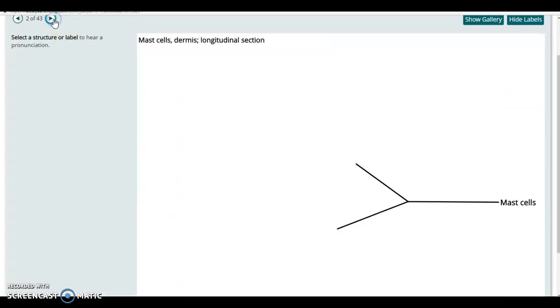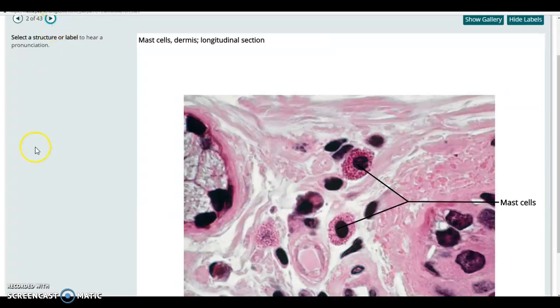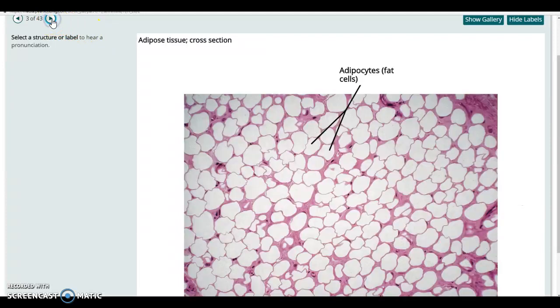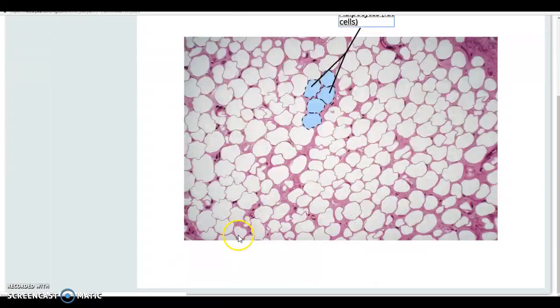Moving along, anything that's dermis, that's related to the skin, we're not going to worry about right now. This is adipose tissue or fat tissue. You can see the nice big adipose fat cells. You can see some of them have nuclei on their surface, big rounded cells filled with fat. But these spaces between here are filled with collagen fibers as part of that matrix background of reticular fibers that the cells are oriented on.